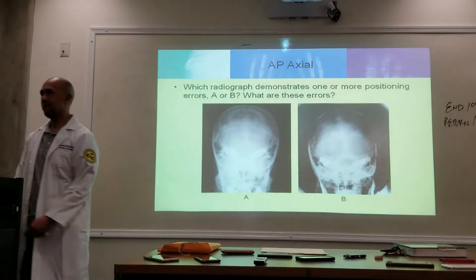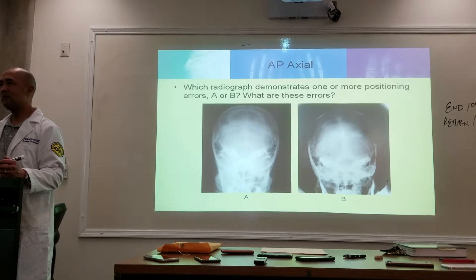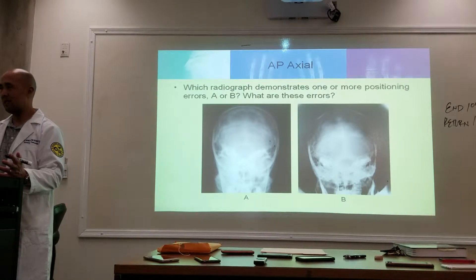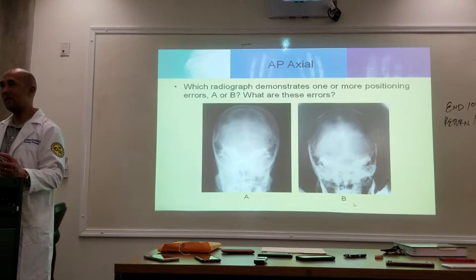They're straight on B. I don't even know if you want to call it an error, but there is just a slight rotation with B, then A, but they both look pretty acceptable to me. Is this a trick question? I thought rotation was with A, and then with B.